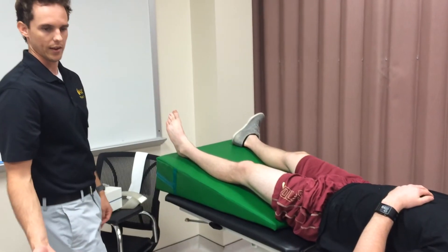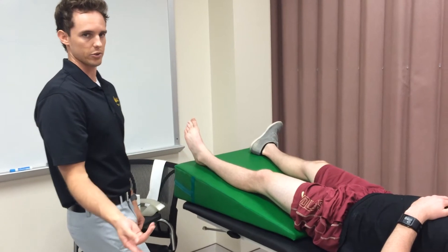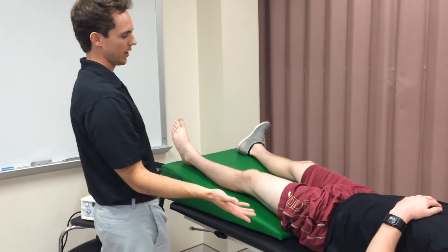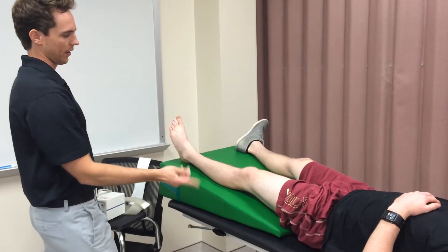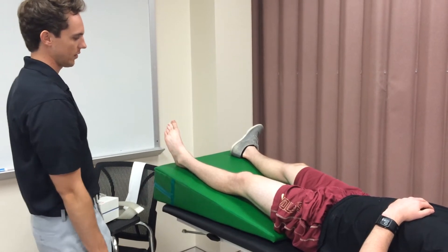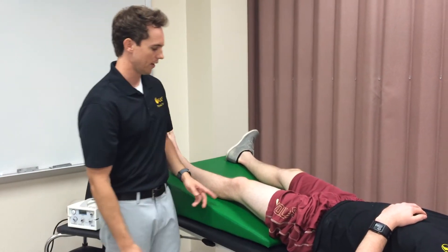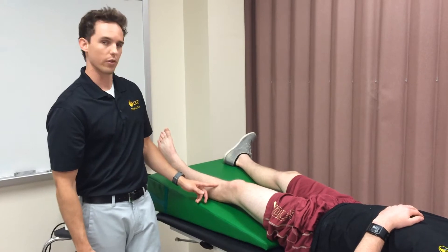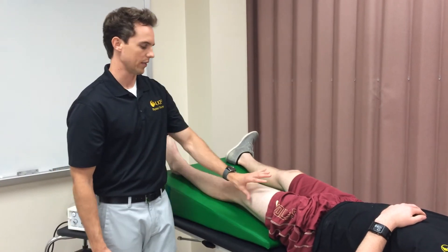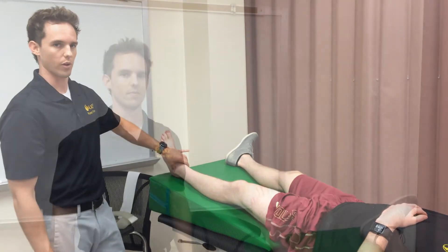I'm going to take a blood pressure measurement before, during, and after the treatment to assess blood pressure. I'm also going to take a circumferential measurement for documentation purposes to quantify treatment. I'll go 15 centimeters below the knee, 15 above to get the bi, and I can do a bimallular measurement as well.